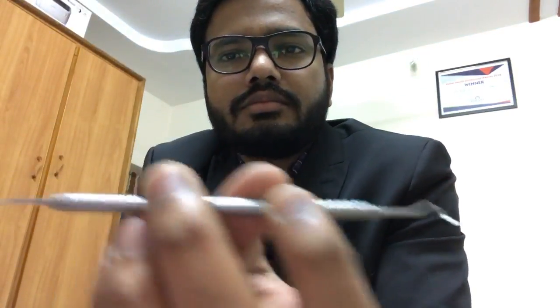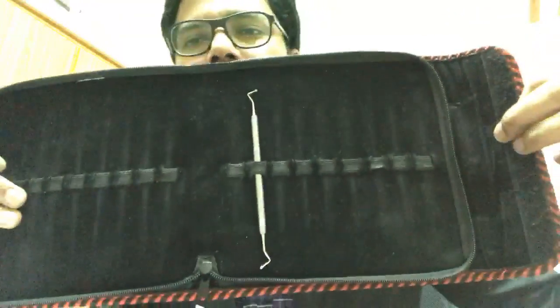Okay. Identify this instrument now. So it's a double-ended instrument. So identify this particular instrument.